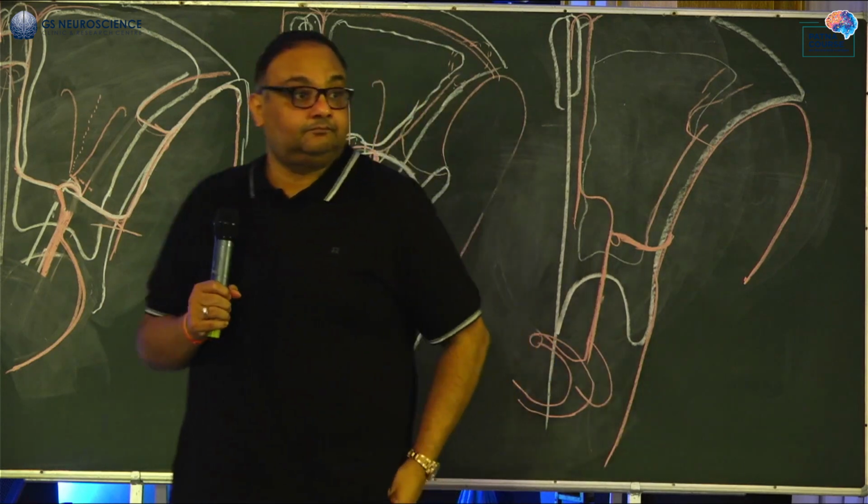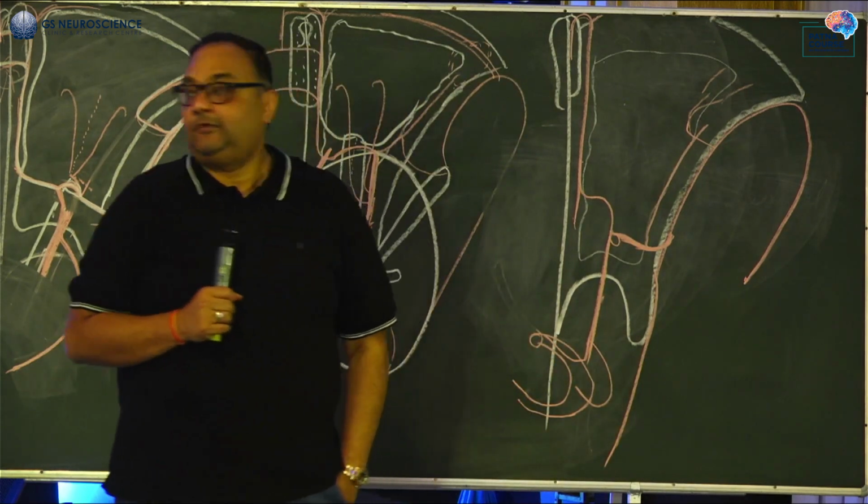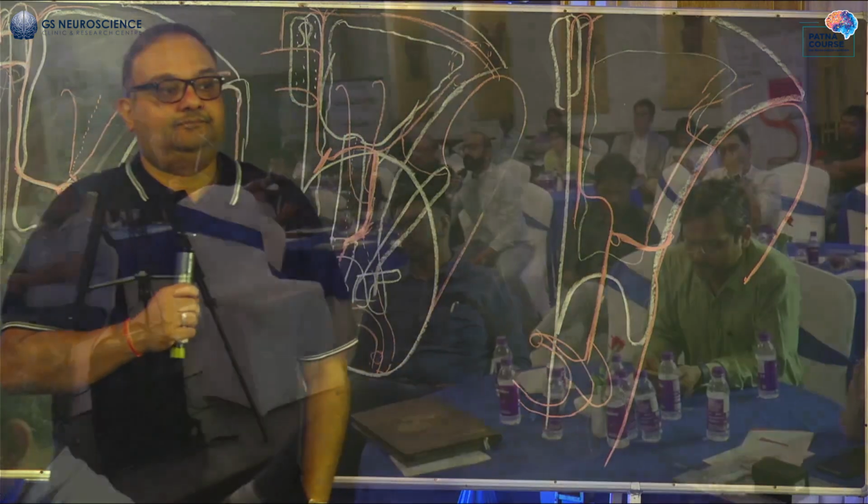Sir, the first case that you say, yes, sir. Kaushik. Yeah. Sir, the first case and the second case, at least the first case was an indirect CCF, no, sir? Yeah, it is indirect CCF. Yeah, sir, type C. When we look into the literature, that is one indication where they talk about venous access being the more preferred access than the arterial access, no, sir? Why did you choose an arterial access for this? It was very easy. Arterial access was very easy in this.